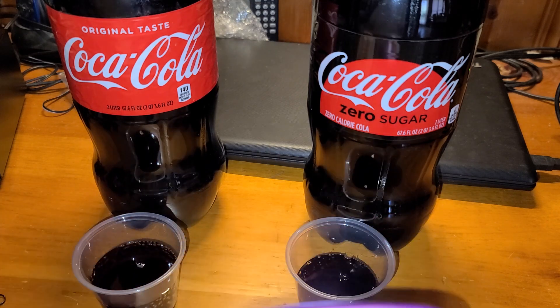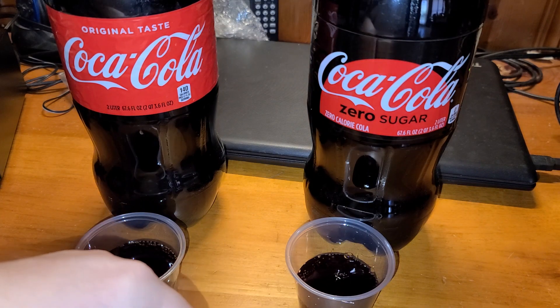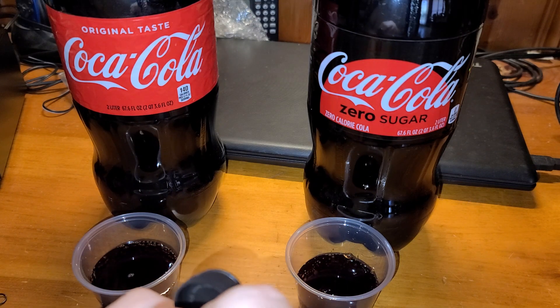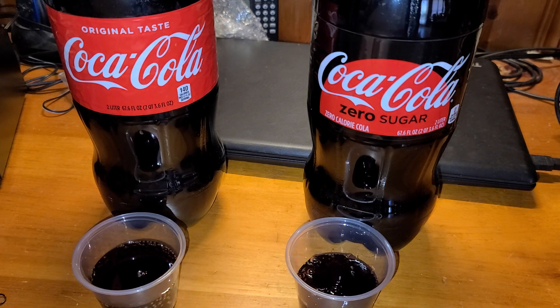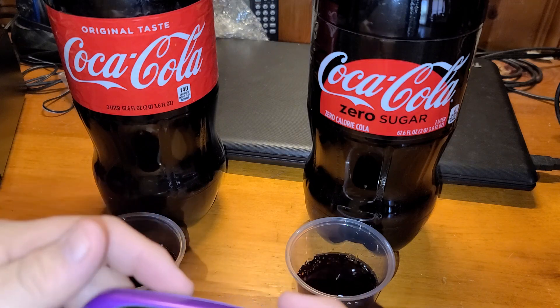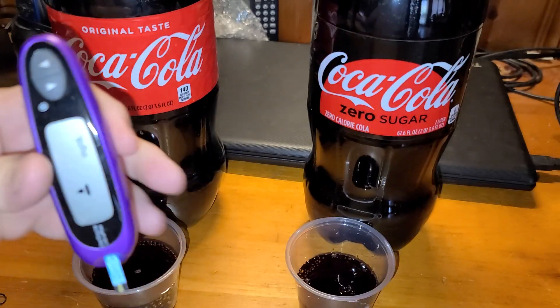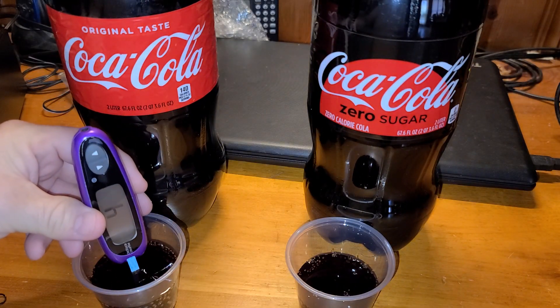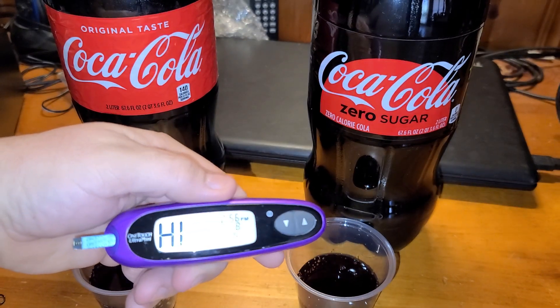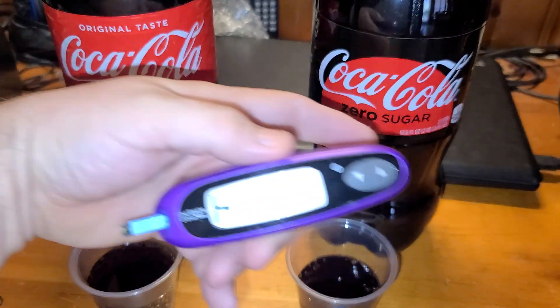Now while I try it in regular Coke, let me change the test strip. Now, like I said, if you're doing keto, this is pretty good — you'll know if you get the wrong kind of Coke or not. So I'm going to go ahead and put it in. Meter comes on. I submerge the strip, and it'll come out high. See that? So you'll know for sure whether you get sugar-free or not.